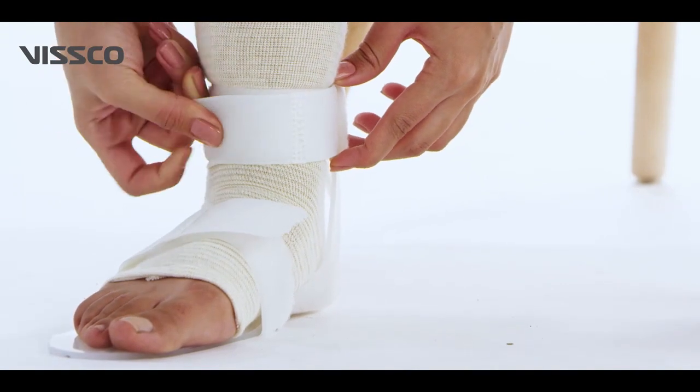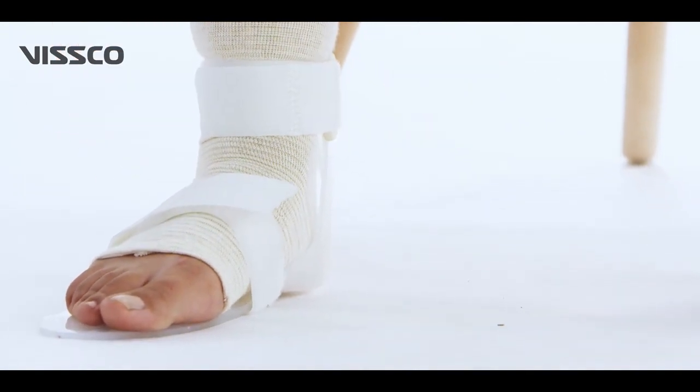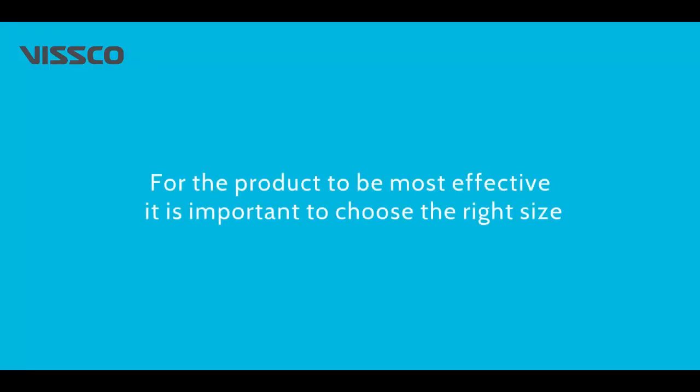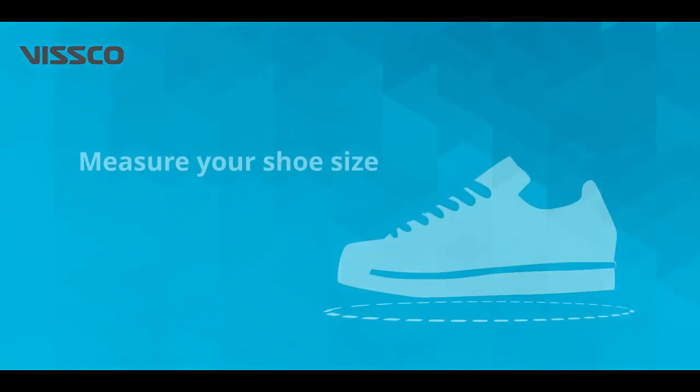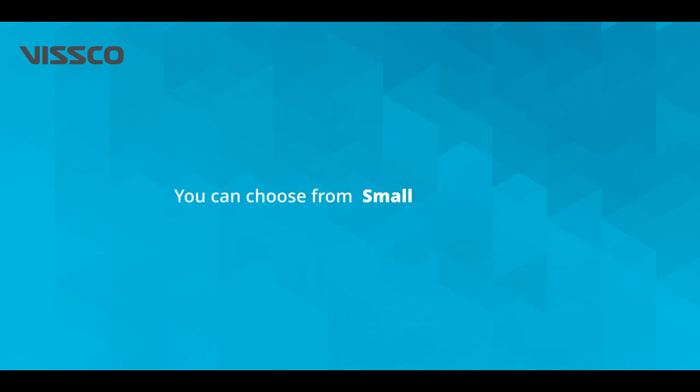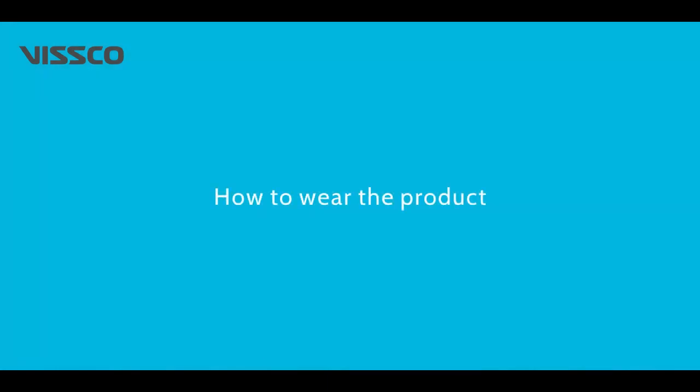It also stabilizes the ankle and foot and is suitable for all foot drop conditions. Now let us choose the right size. Measure your shoe size and select from the size chart on the box. You can choose from small, medium, and large sizes. Now that you have selected the right size, let's wear the product.